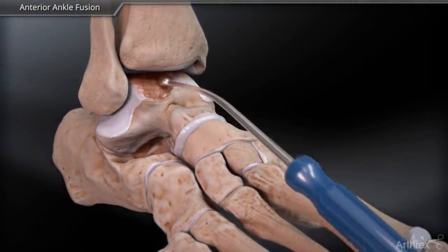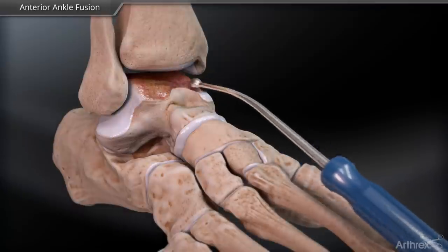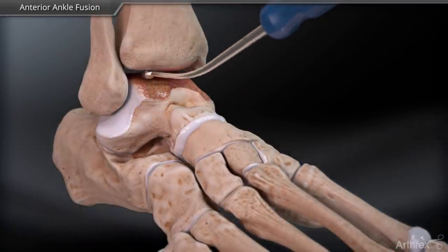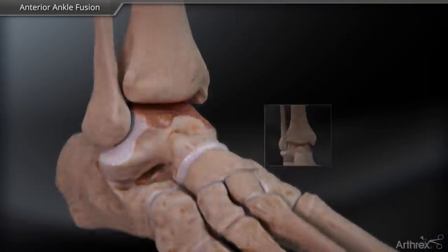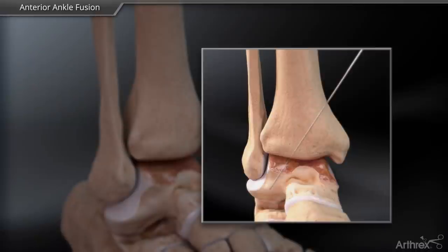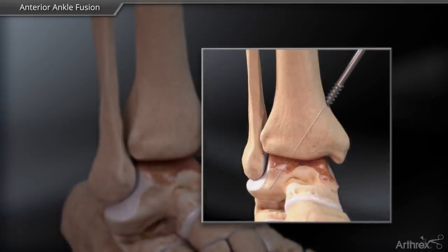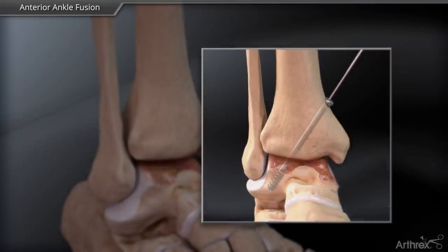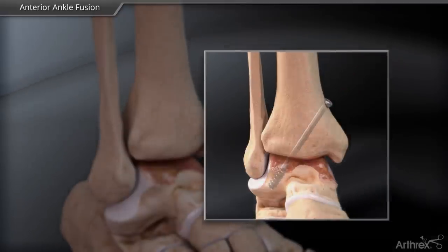Remove cartilage from the ankle joint using a round curette. Optionally, an LPS cannulated 6.7 mm lag screw can be driven over a guide wire, entering proximal to the flare of the medial maleolus through the center of the tibiotalar joint to establish initial compression.